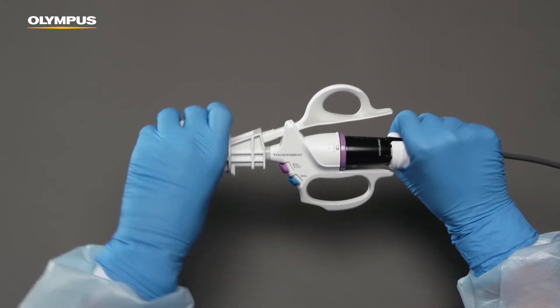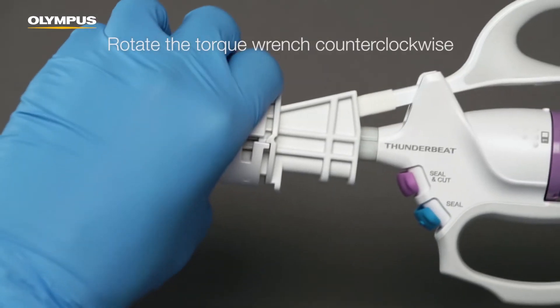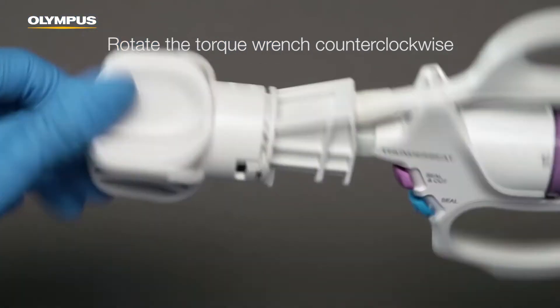Hold the stabilizer firmly and rotate the torque wrench counter-clockwise until the transducer is loose.